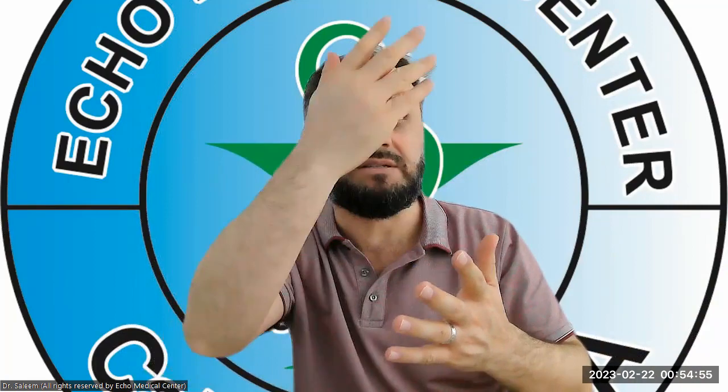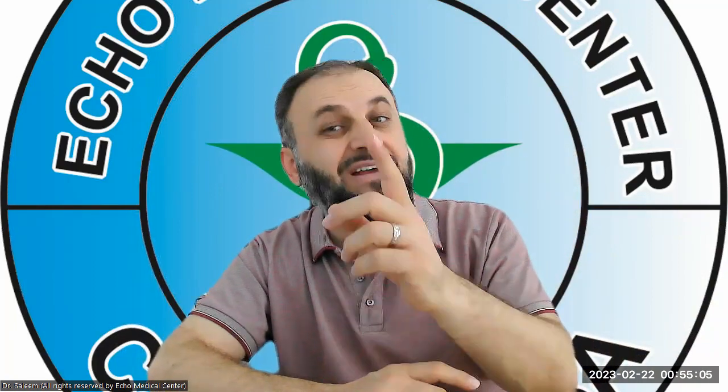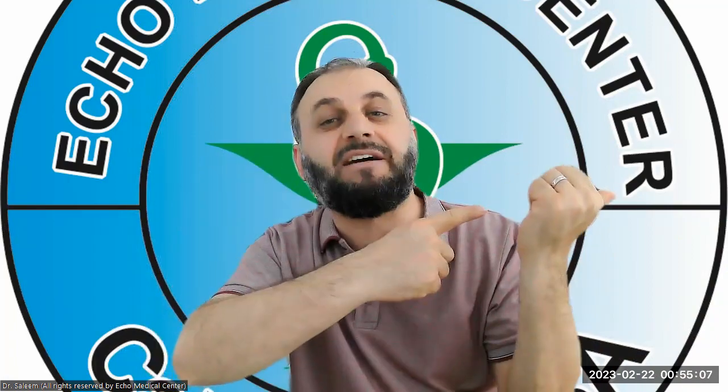Okay, and then after the proximal, you jump to the mid, same thing: gray, color, and we take the Doppler study or spectral waveform to see the peak systolic and diastolic flow. And then after that, we jump to the bulbous area. So after proximal, mid, distal, we go to the bulbous. Now, in the bulbous, if you want to make it easy for yourself, steer your box to the left. In that case, it will give you better image quality and a better Doppler shift in that area.